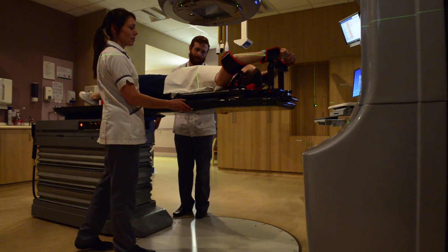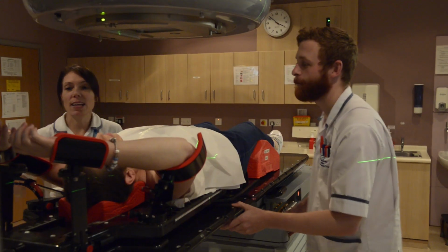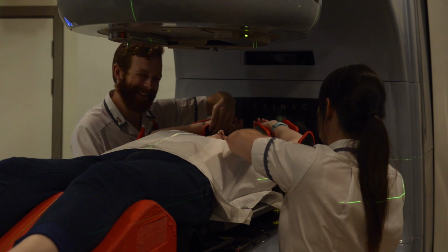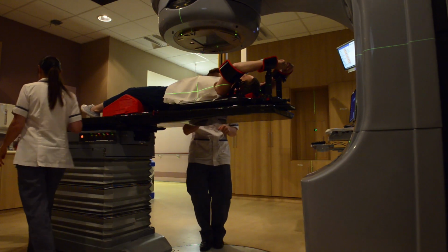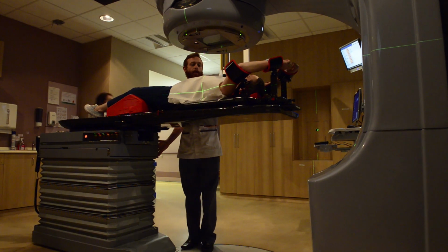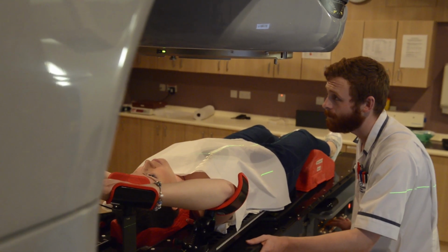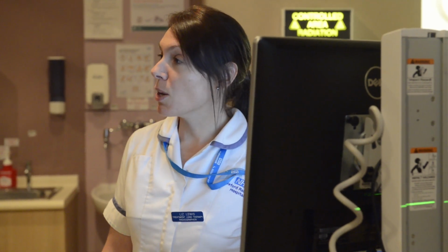The breastboard that we have is the same in the CT area and also in for treatment. It will be set up for you individually every day, and that is specific for you and for your treatment. Unfortunately, the bed has no padding on it, and there is a reason for that. If we had a mattress on there, you would roll around, and because we're trying to achieve accuracy within millimetres, that would allow you to shift, and that is what we're trying to avoid.